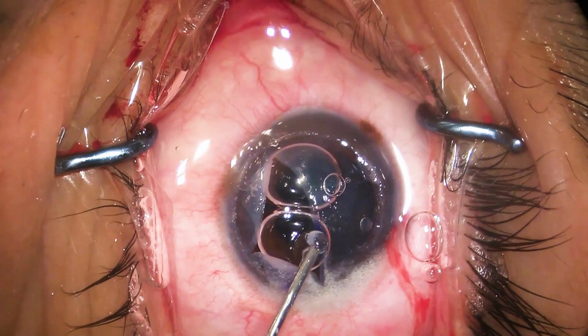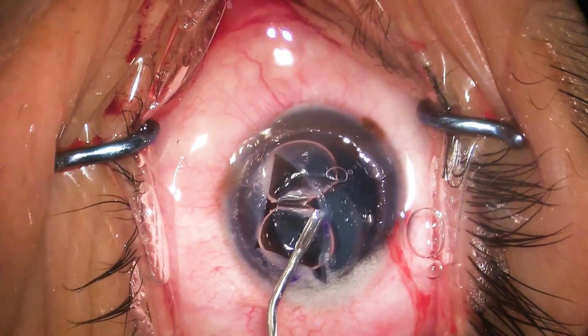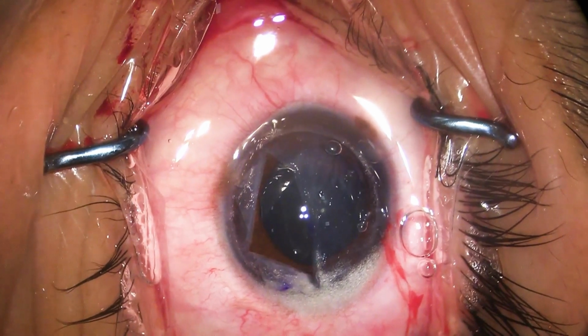On stromal dissection, mere injection of visco between the stroma and the bare Descemet to separate the stromal lamella led to rupture of the Descemet membrane because of its fragile nature.